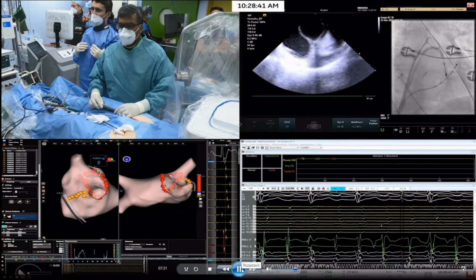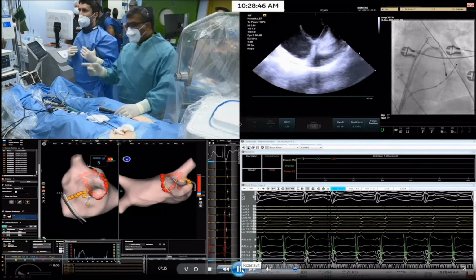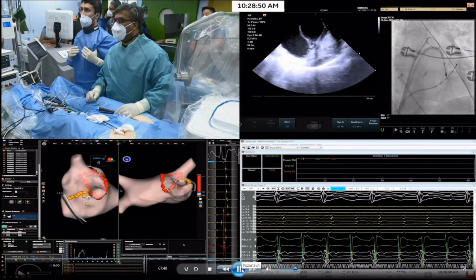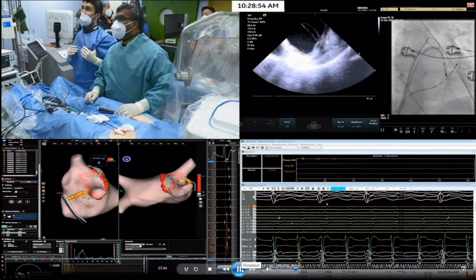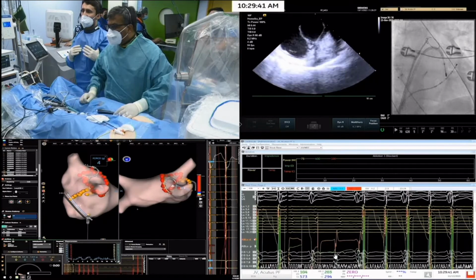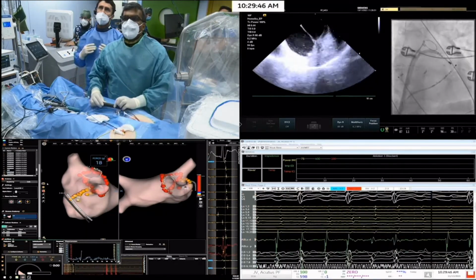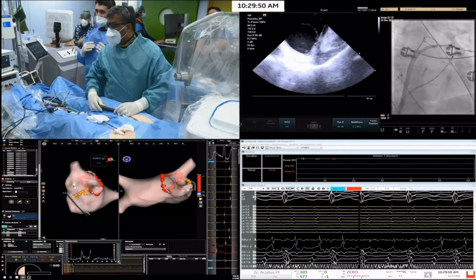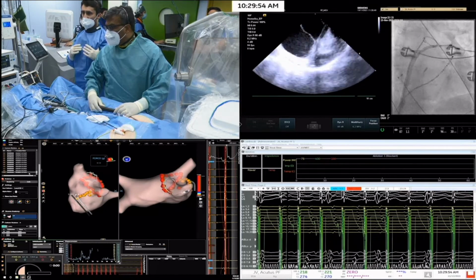Okay, so now clearly the activation of the atrial tachycardia changed. The sequence is changed, and after finishing this mitral line, they tried to get entrainment, and I hope that it will be soon again faster. Yes, it is, and after that he decided to go to the coronary sinus. I need to advance the thinking, because I know the case, so I have an advantage.